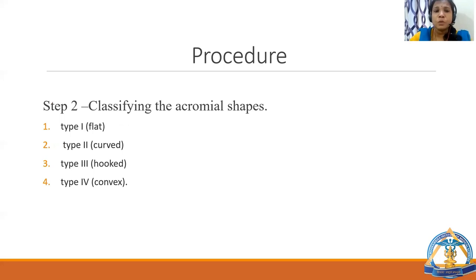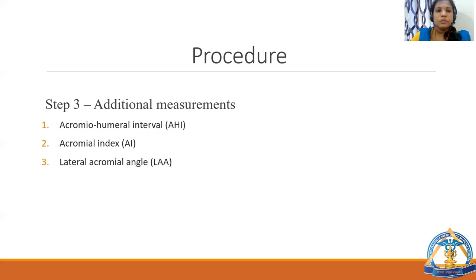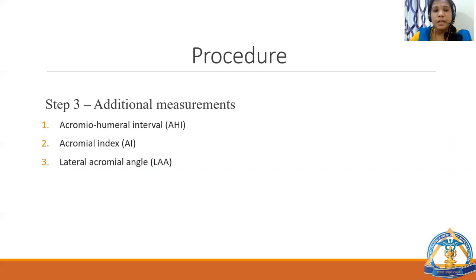Step 2 was to classify the acromial shapes. There are 4 acromial shapes: type 1, type 2, type 3, and type 4. Step 3 involved additional measurements: acromial humeral interval, acromial index, and lateral acromial angle were measured.